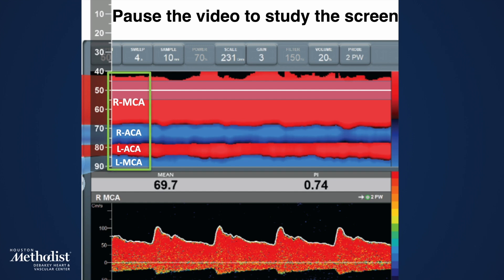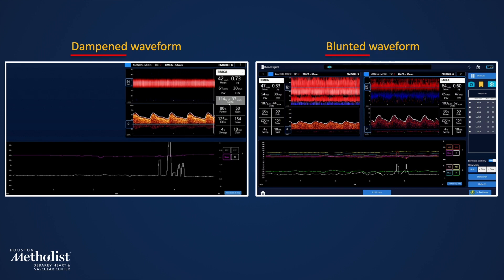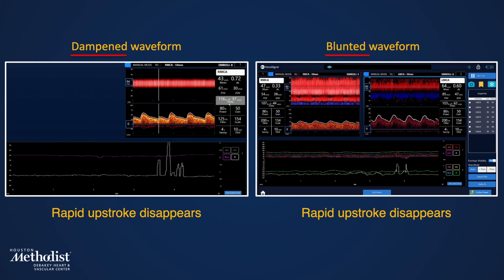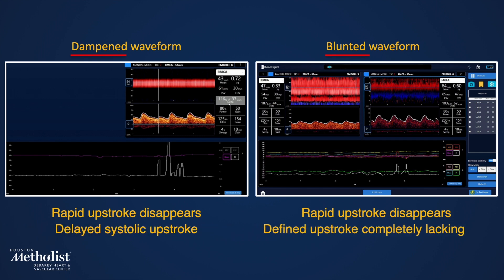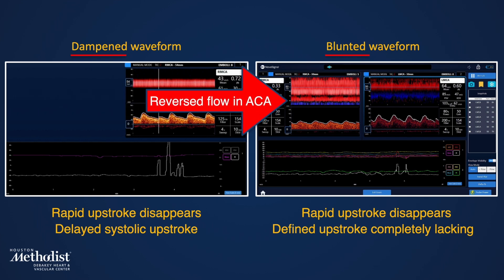Patients who need a carotid intervention often display dampening or blunting of MCA waveforms. In both cases, the rapid systolic upstroke disappears because of a proximal stenosis. When the systolic upstroke is delayed, we talk about a dampened waveform, while a blunted waveform completely lacks a defined upstroke, signifying a more severe proximal stenosis. Notice the reverse ACA in M-Mode as an important collateral in our blunted waveform example.